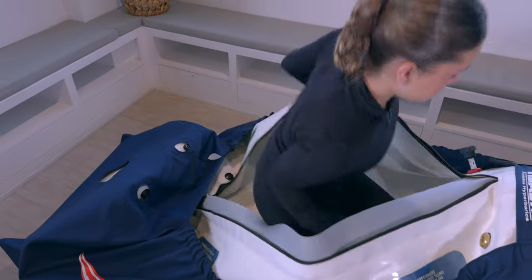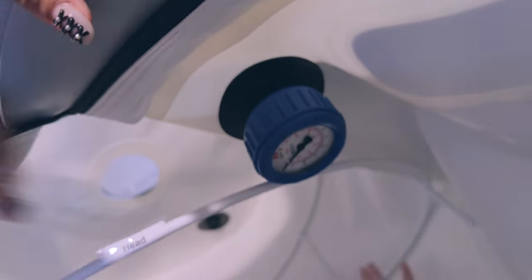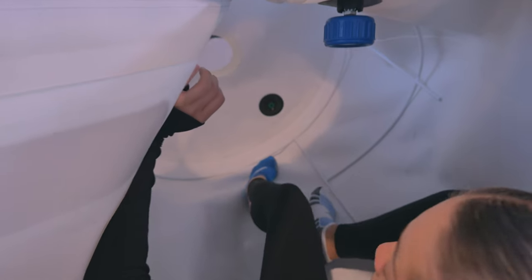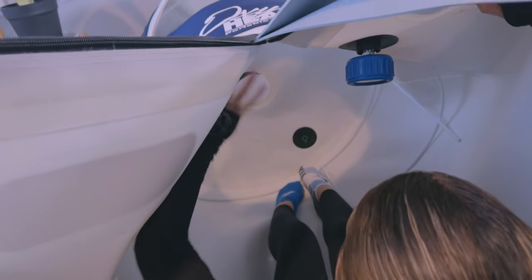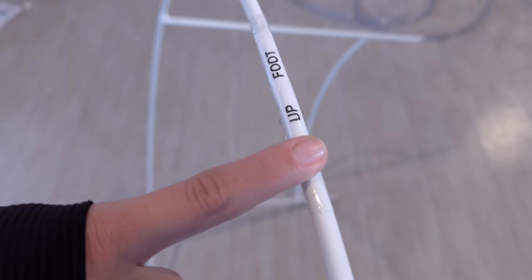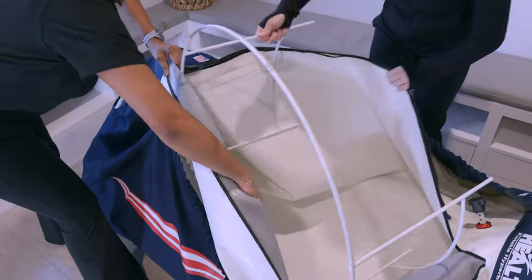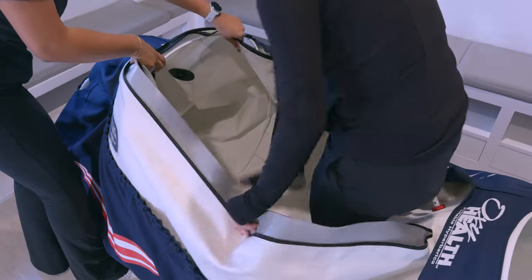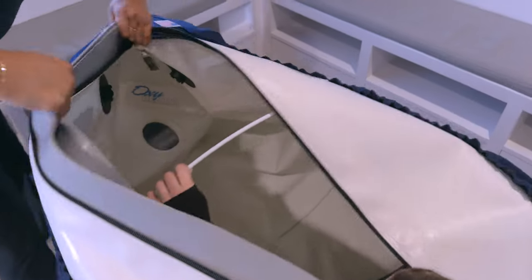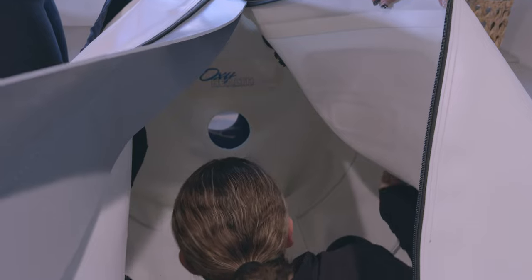Next, climb into the chamber. From a seated position, begin to push and wiggle the head frame into position — mind the pressure gauge. Use your feet and arms to continue to push it into place. Next, take the foot round frame with the up-foot sticker side up. Place it sideways into the chamber opening, clearing the zippers. Once past the zippers, pivot the frame — the sticker side should be up and facing the end of the chamber. Climb into the chamber again to finish maneuvering it into place, using your feet and arms to finish pushing it toward the end of the chamber.